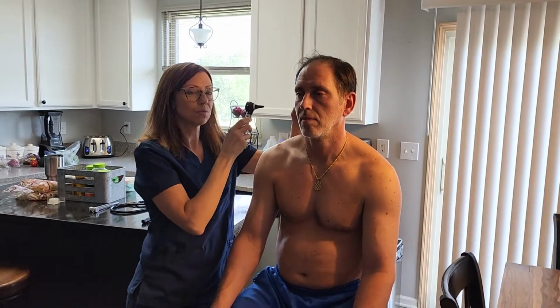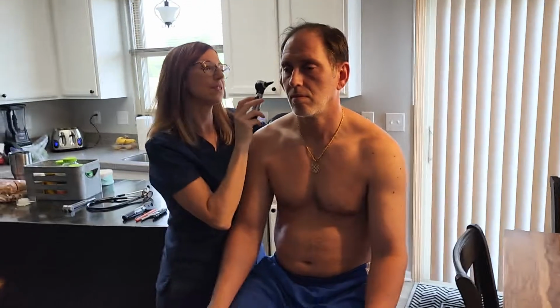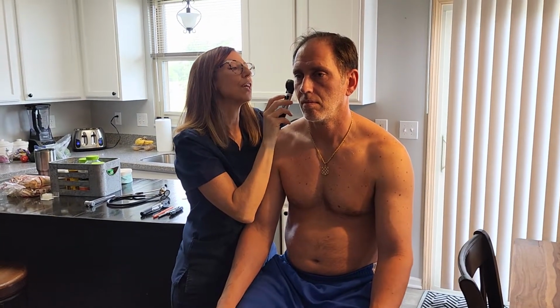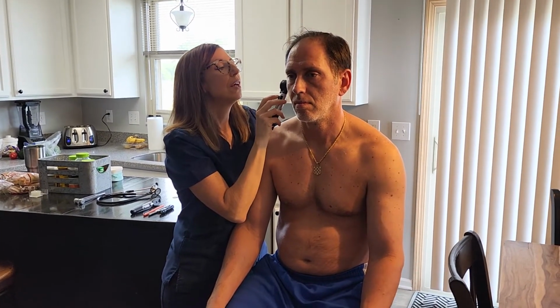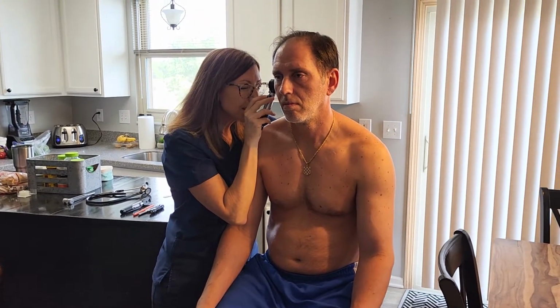No. Okay. And now I'm just going to take my otoscope and I'm going to look at the internal structures of the ear as well as the internal ear canal. And I'm looking for any cerumen, excessive cerumen. I'm also looking at the tympanic membrane to make sure there's no swelling, redness, it's not perforated. So I'm going to make sure I don't touch the external part of the ear canal here to cause any pain. Is there any pain?